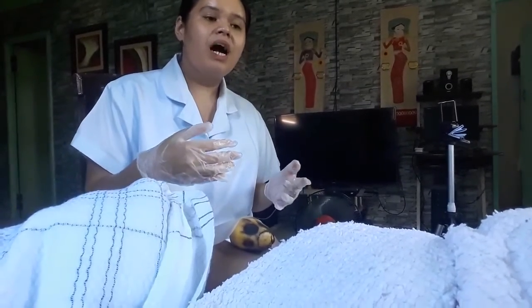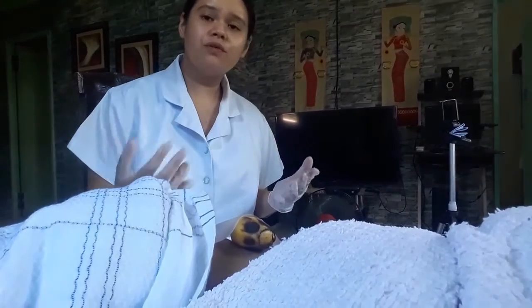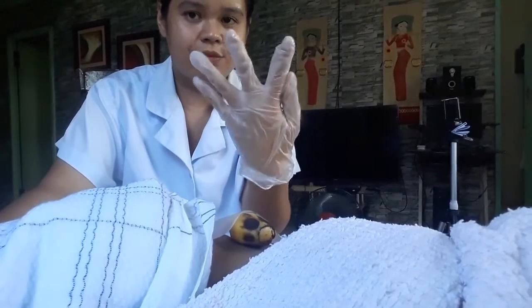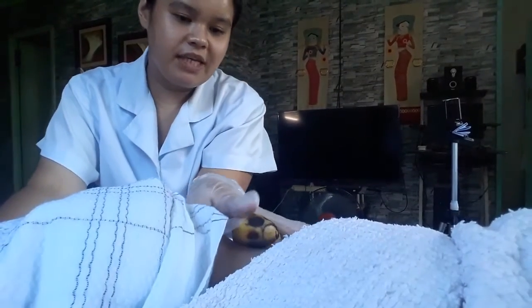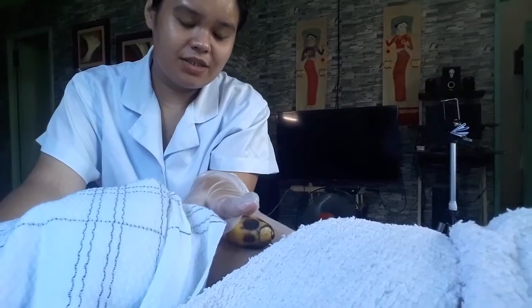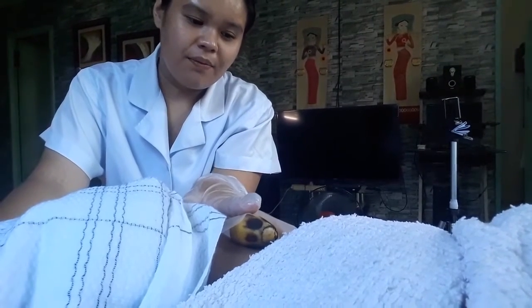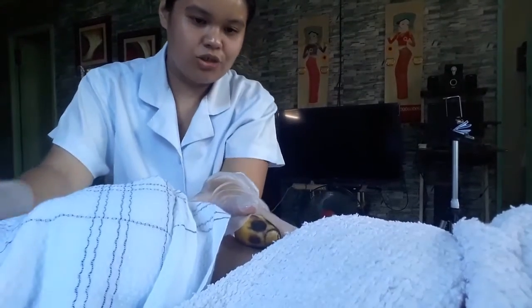I will look for the anatomical landmark to see the site again. Then after that, I will use a V shape like this one to ensure that this site is where the muscle is, where I could inject the medication.